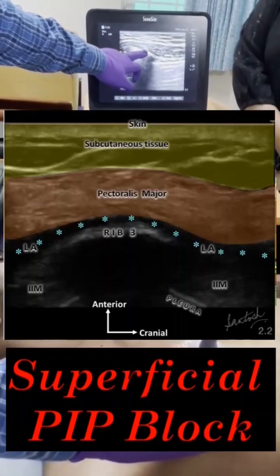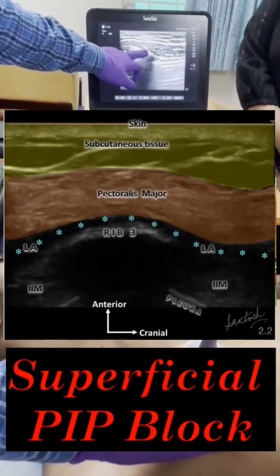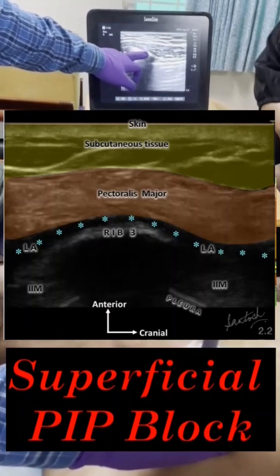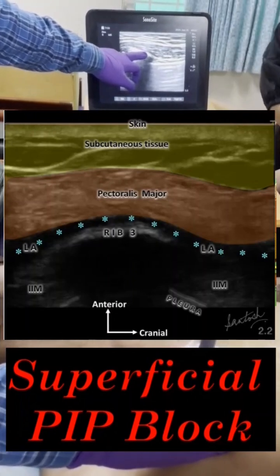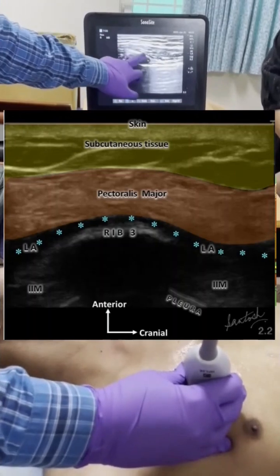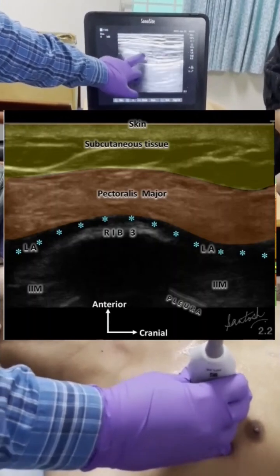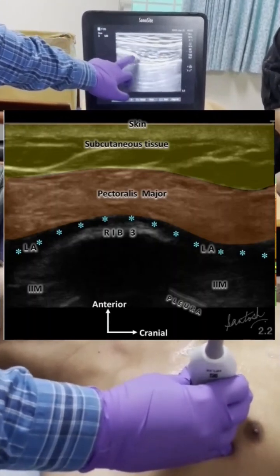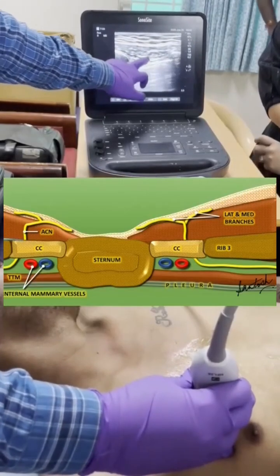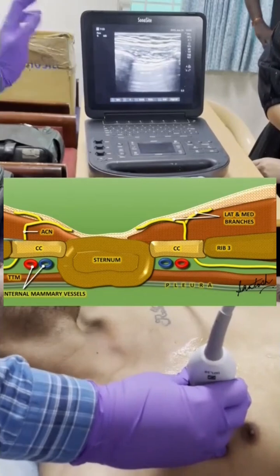That will be your superficial PIP — or superficial parasternal intercostal plane, or pecto-intercostal plane. This is the intercostal muscle here. Either you can come here, hit the rib and deposit the drug, or you can come in this plane and deposit the drug.